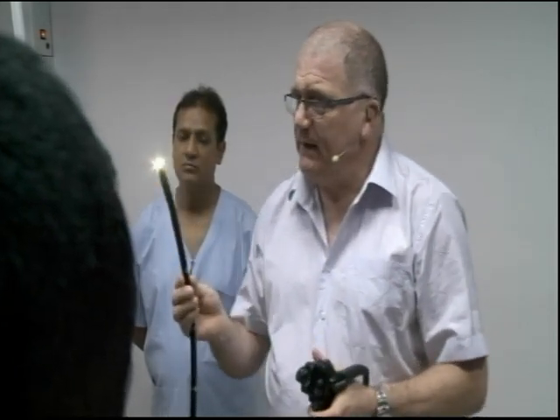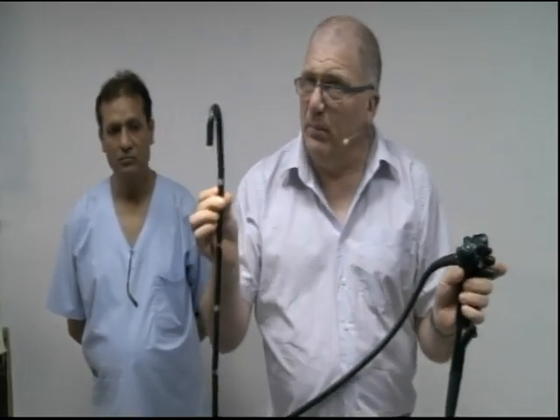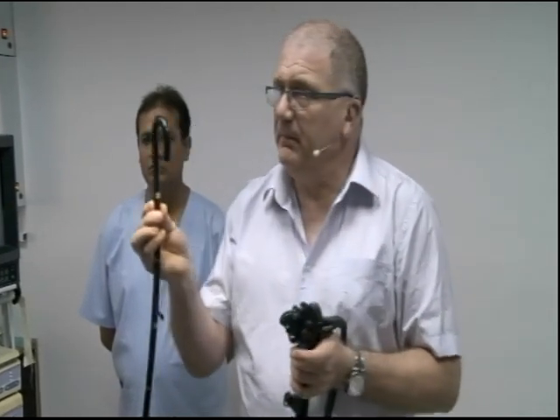When we retroflect, when we make it look back on ourselves, how can we increase this? How can we make that look more acute? That is the tip up all the way. I say upper turn for retroversion. Yeah, that's very important. These concepts are important. What will you do to make it look even more towards its own? Push.